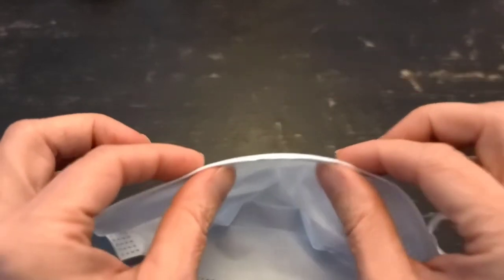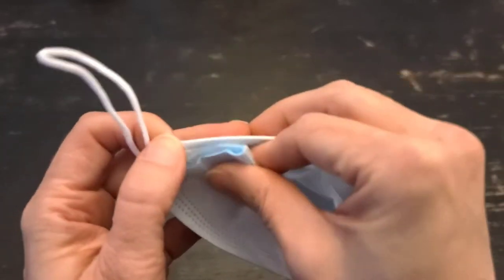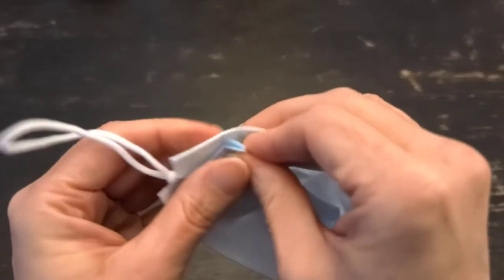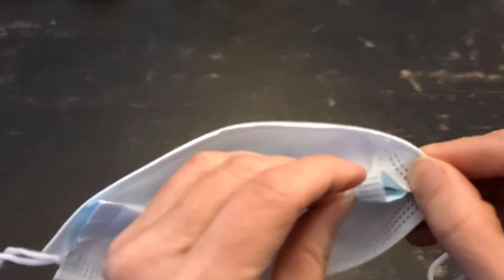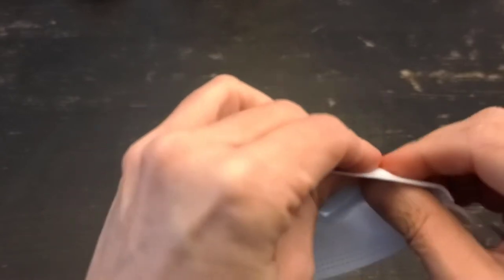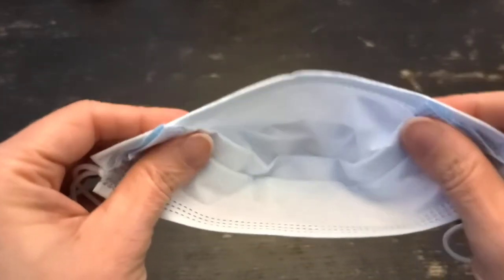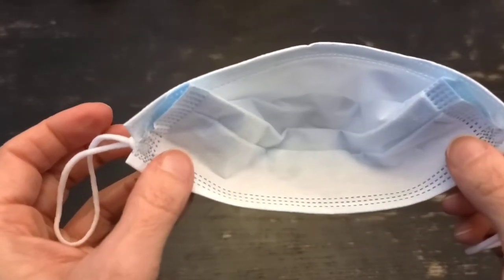This is the top of the mask — the bendy nose part. You're going to flatten that excess up against the top, against the part that's going to go on the top of your face. So that's what it's going to look like, and now let's put it on.